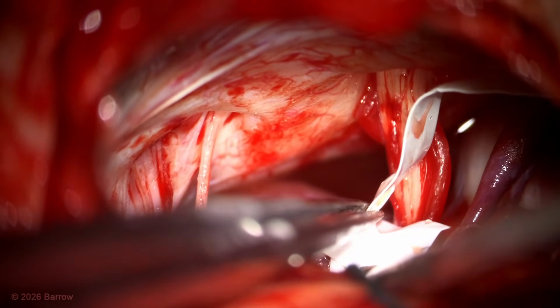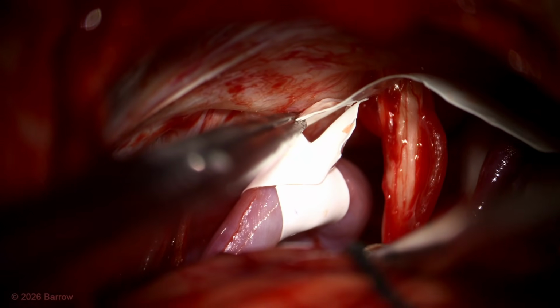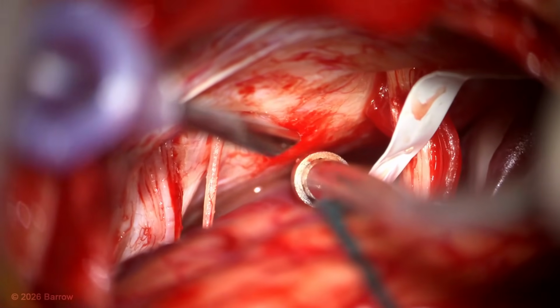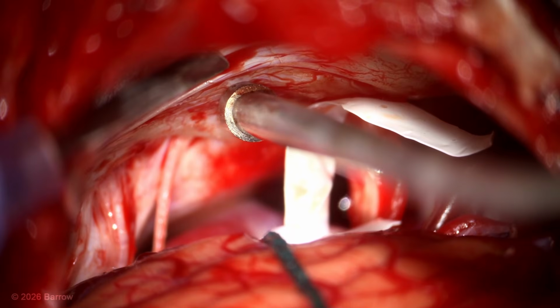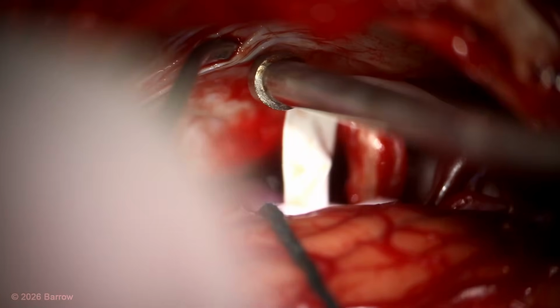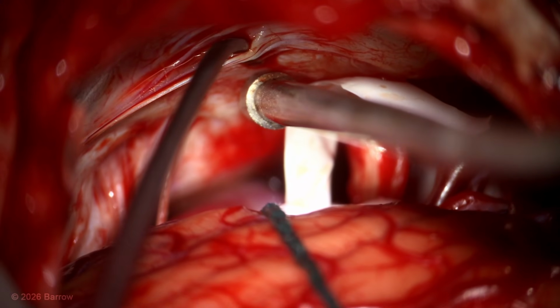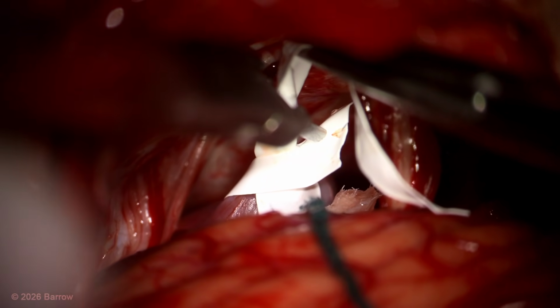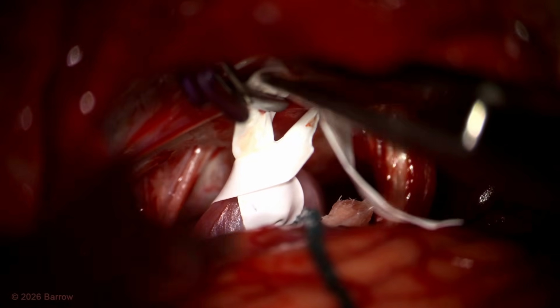The lasso now becomes a single-armed lasso that can be fixated to the clival dura with a clip. Normally, I secure the lasso here in the lateral clival dura, but the dura is very thin. Therefore, I'm transitioning to thicker dura more laterally. Here you can see those folds of dura right near the endolymphatic sac. These provide a nice, strong anchor for the anterior blade of that aneurysm clip. The posterior blade goes around the lasso, and together it holds the tail against the clival dura.